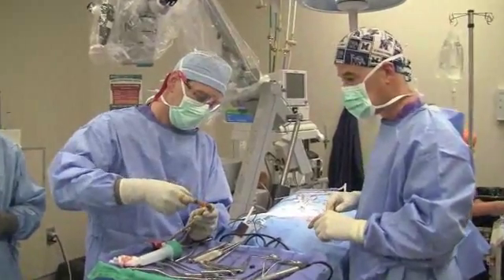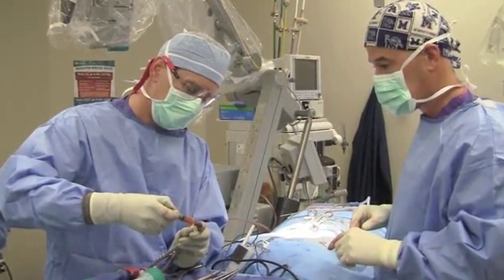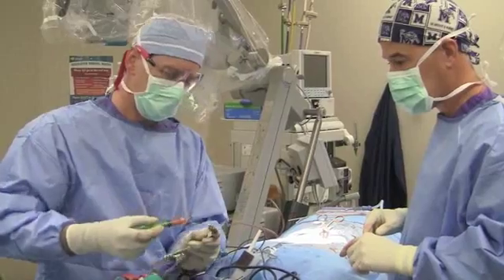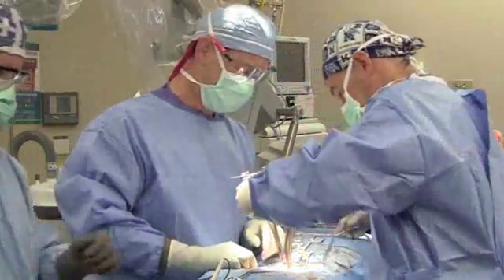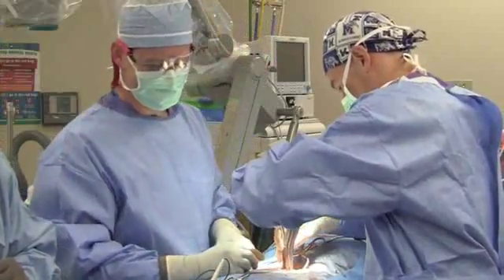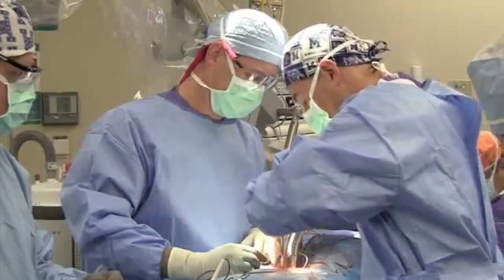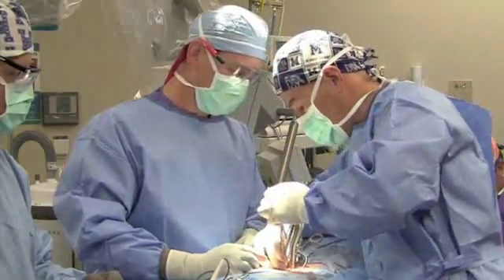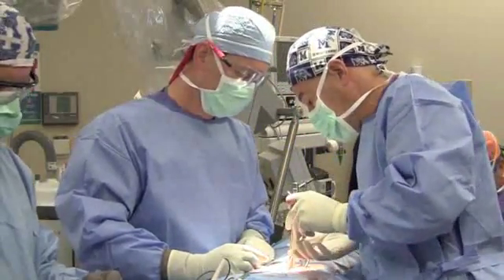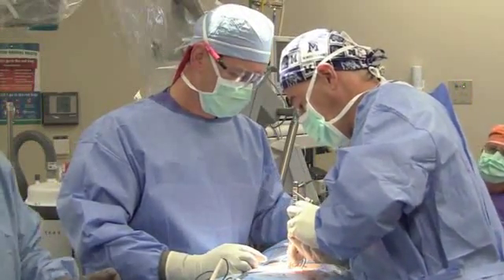We're now preparing the device by placing bone putty and some of the patient's own bone into the barrel of the device. Once we've done that, we then use the instrumentation to carefully place the device in between the spinous processes. Once placed, we remove the rest of the instrumentation, which allows us to leave the device in place.